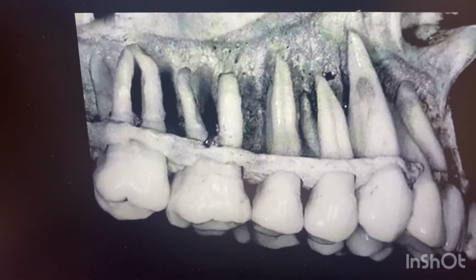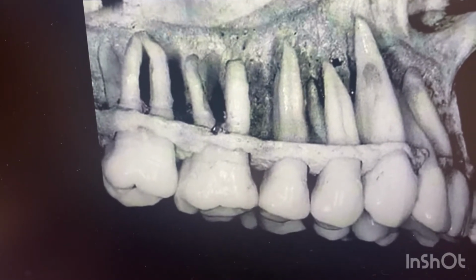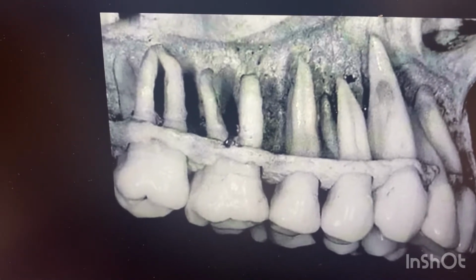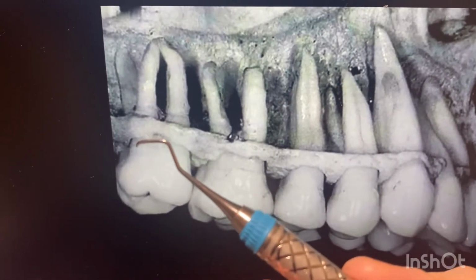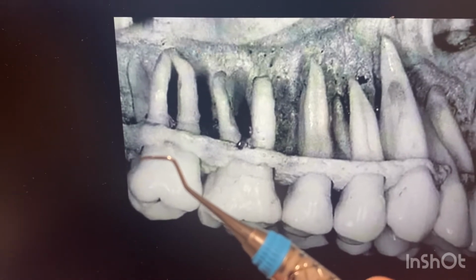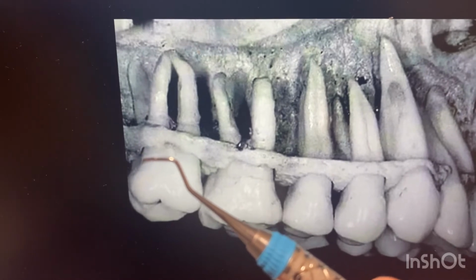Okay, so we are going to start with the posterior teeth. I don't have a typodont, so we will use this image instead. When using this instrument, we want to establish the correct working end. When using this side, we see that the terminal shank is going across the tooth, but we want to make sure that the terminal shank is parallel to the tooth we are working on.